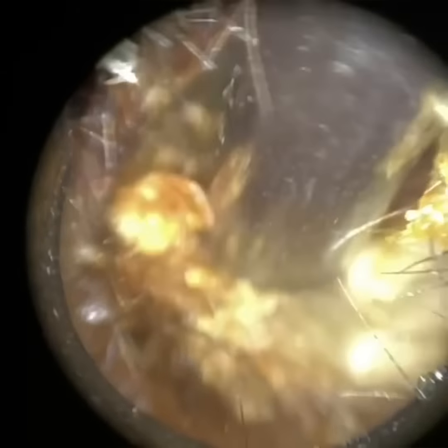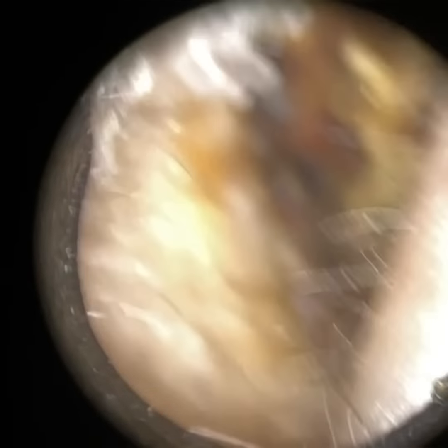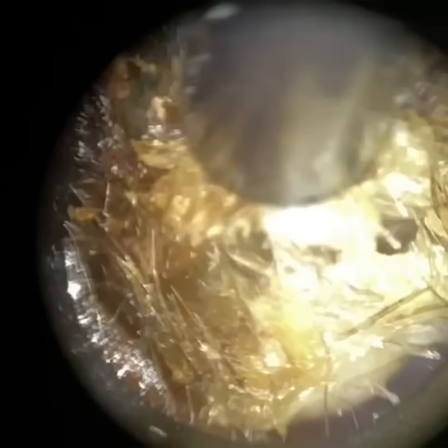And it typically forms in a lamellar structure, so like an onion-like structure, where these individual skin cells, as they shed and come off the surface of the ear canal, they should individually disconnect from one another. With Keratosis obturans, quite commonly, although the skin cells have shed off the canal wall, they haven't lost their interconnecting links, so you get long chains of dead skin. And if someone's got a skin condition, of course you're going to have more dead skin in the ear, and that's that white peripheral matrix that I'm referring to.